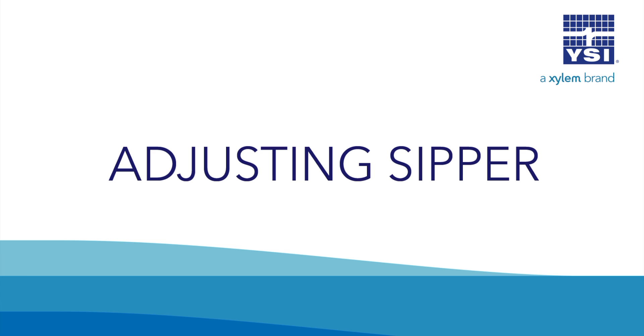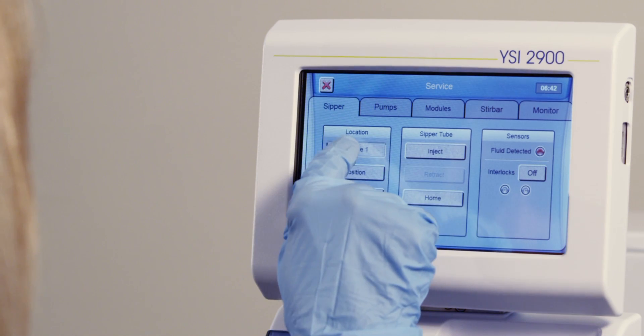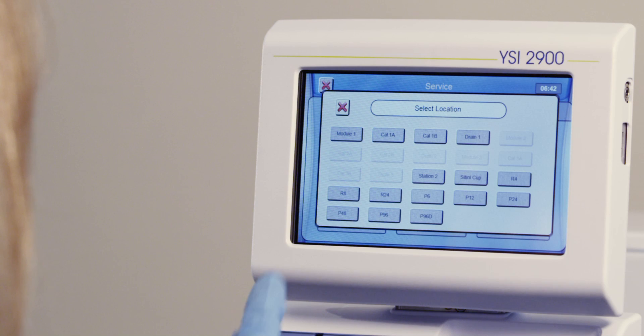If you have not adjusted your sipper yet, from the main screen, press Service. Under the sipper tab, press Module 1, then press Position.